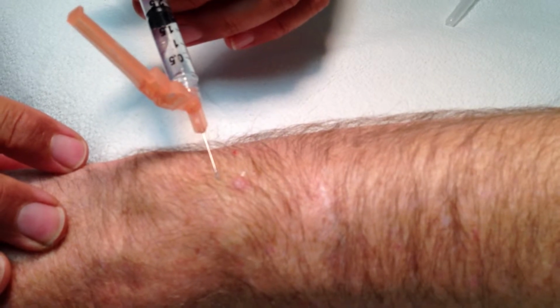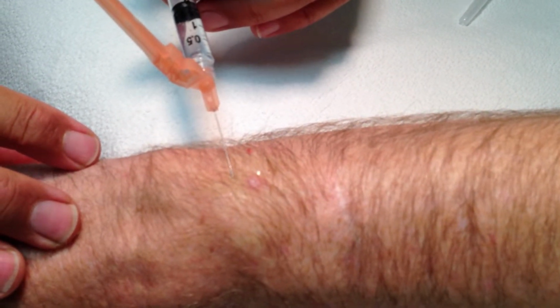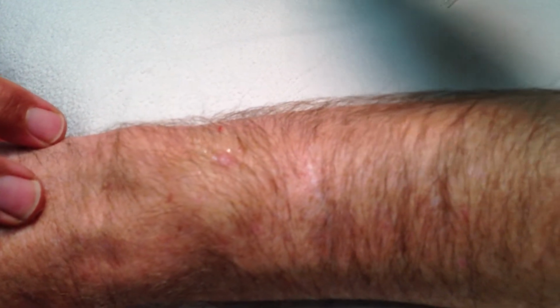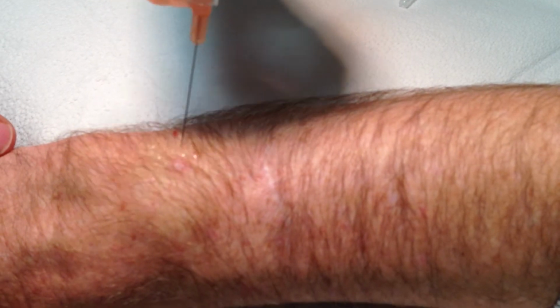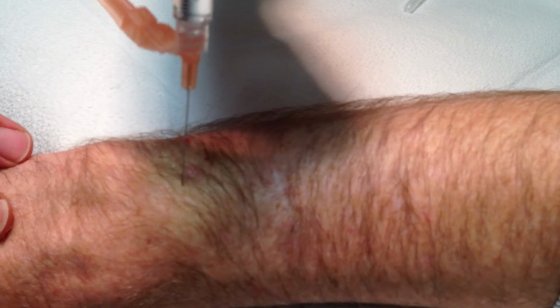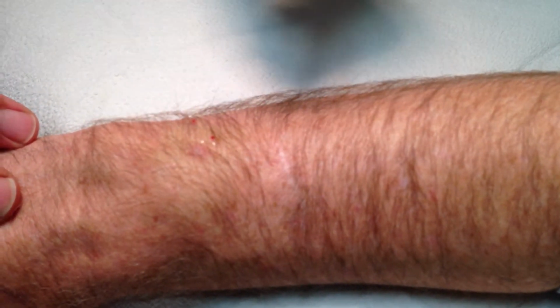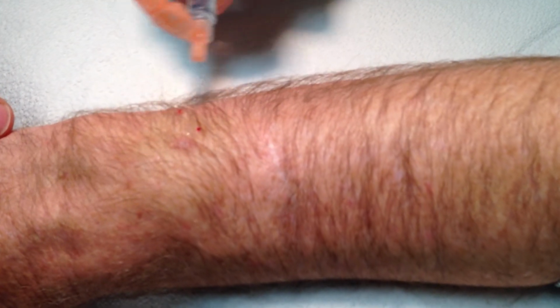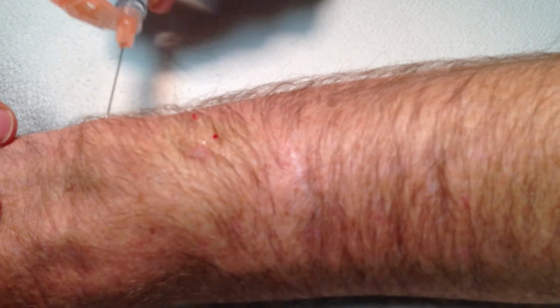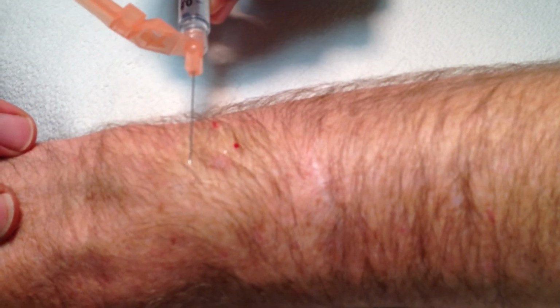And I've come to the south end of this lesion, and it should be nice and numb. And as I test it out, I'll poke him a little bit here and ask if he feels anything sharp. Not yet. Okay, so that whole zone, and it's imperceptible, but he's starting to blanch because this has epinephrine, and you've got pink area over here, pink area over here, and it's paler here because of the vasoconstriction.